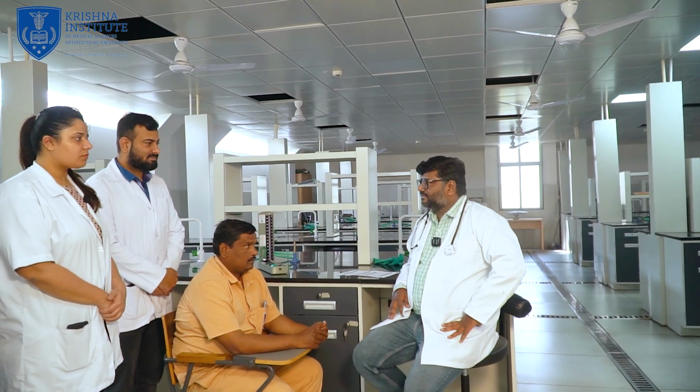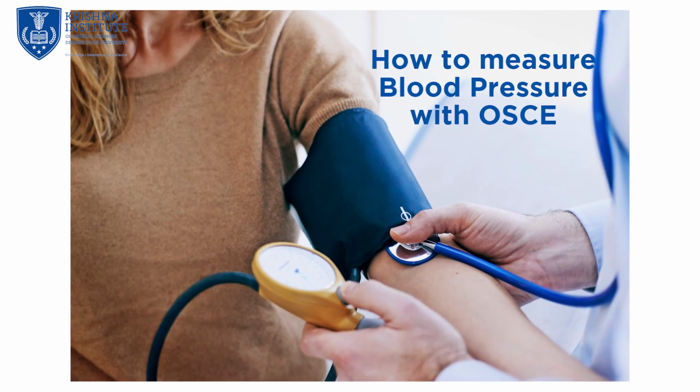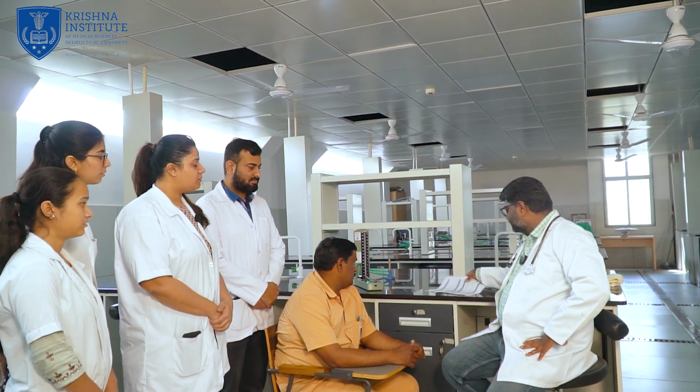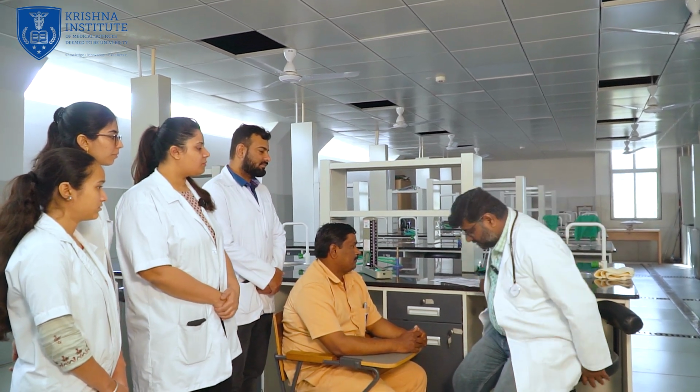I am Dr. Prashant Gunkikar, Associate Professor in the Department of Community Medicine. Today we will learn how to measure the blood pressure appropriately with OSCE. OSCE is Objective Structured Clinical Examination. As per the OSCE, we will measure the blood pressure today, and this is the checklist. How are you supposed to check the blood pressure? Step by step, I will explain.